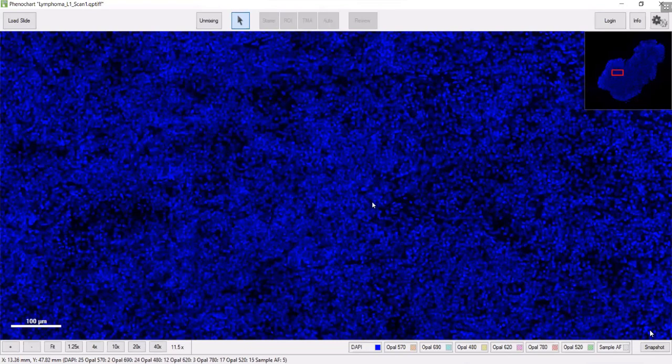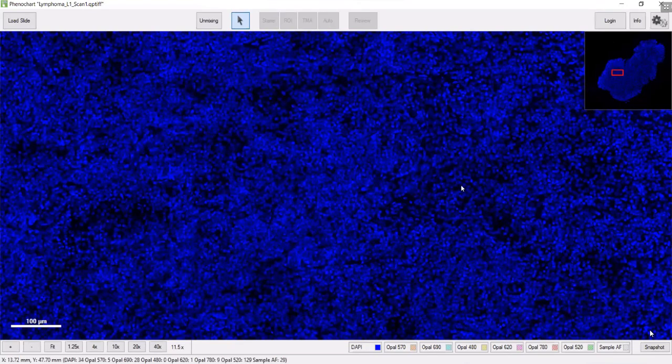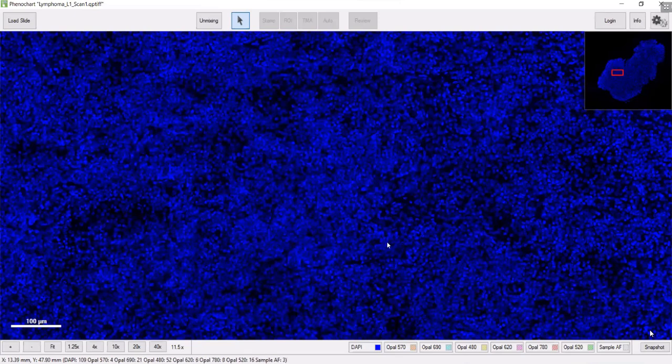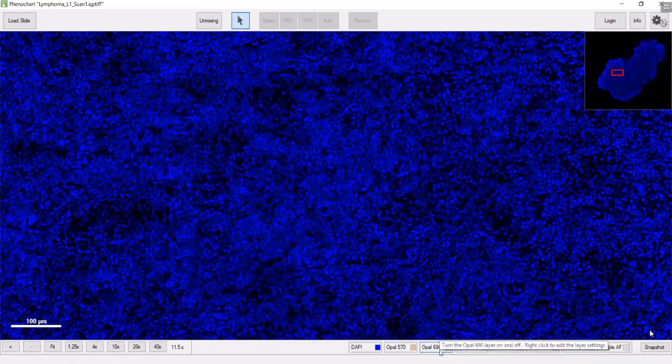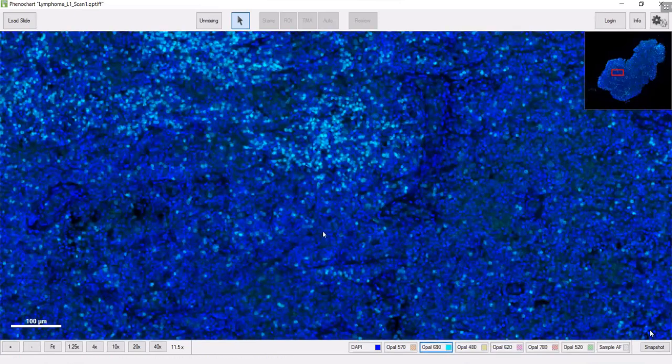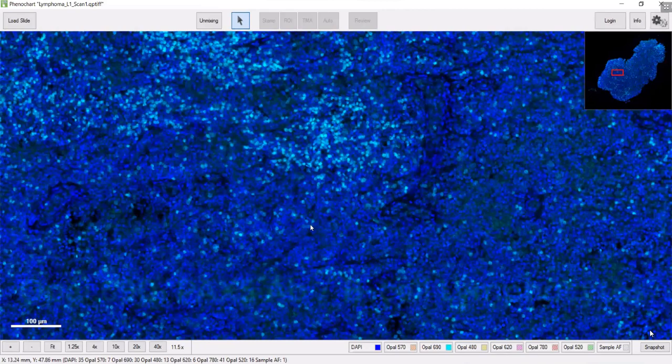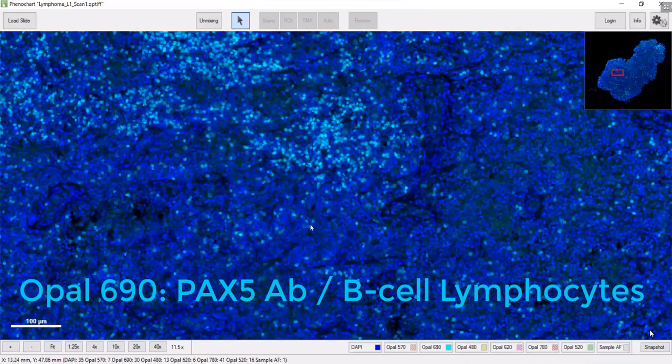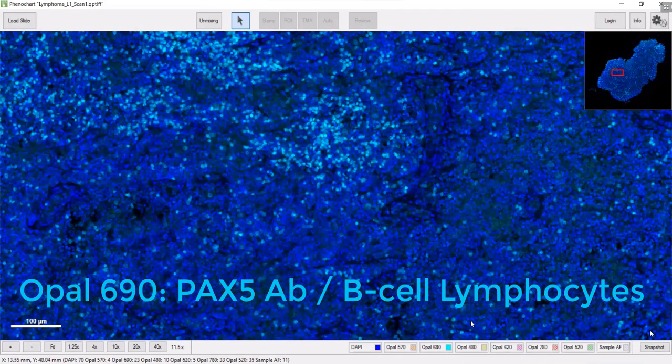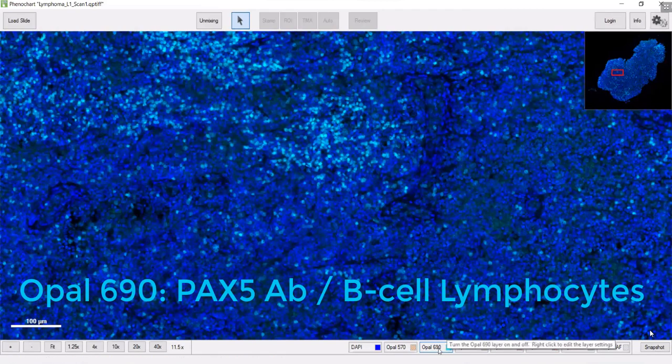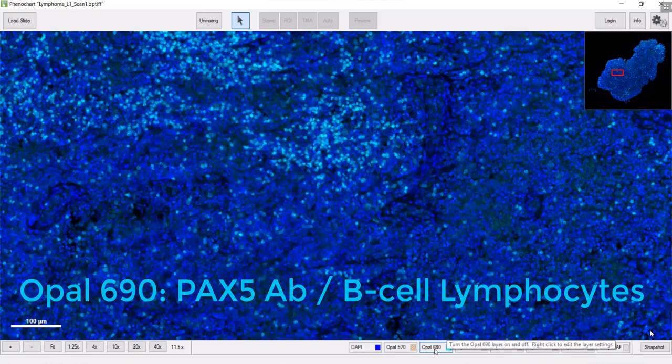I'm zooming in now. You can see the whole sample up there. The first thing I'll turn on is the tumor marker. In this case, it's a Pax5 antibody, which is good for detecting lymphoma.